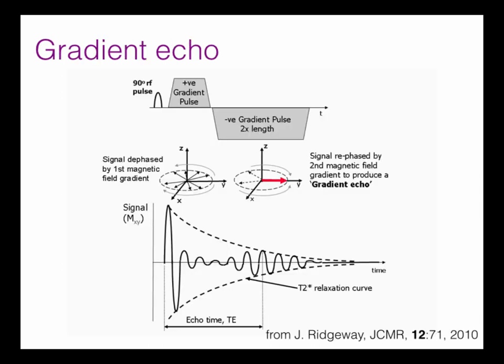Okay. Next thing that Vinay also discussed was a gradient echo pulse. So having excited our slice, we now apply a gradient in an orthogonal direction. If we apply a small gradient pulse like this, what will happen is our spins will dephase. Then, if we turn the gradient the other way around, it should cancel that effect because it's all just rotation. So if you apply the gradient in the other direction, they'll spin back, and when you've got the same amount of gradient pulse on this side, you find an echo signal, and this is called a gradient echo. And this is usually how this is presented.